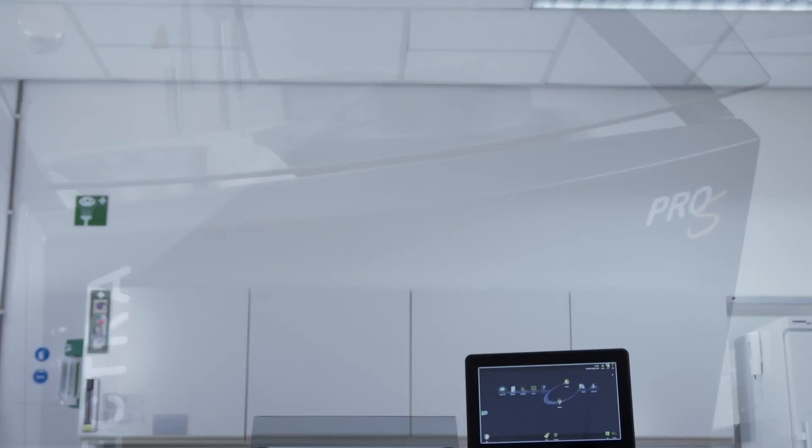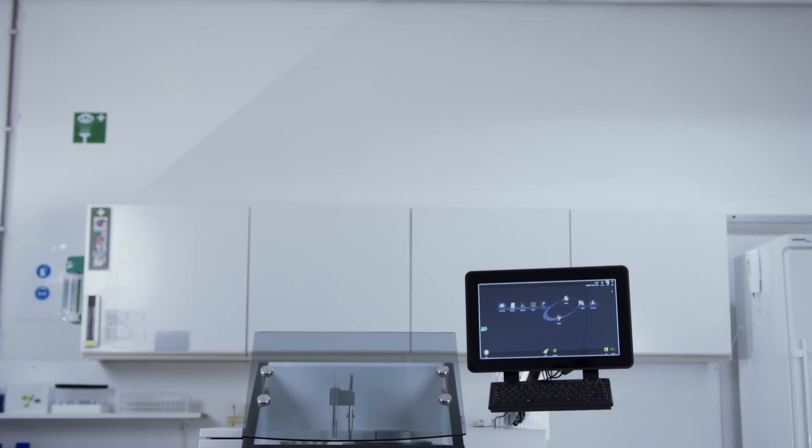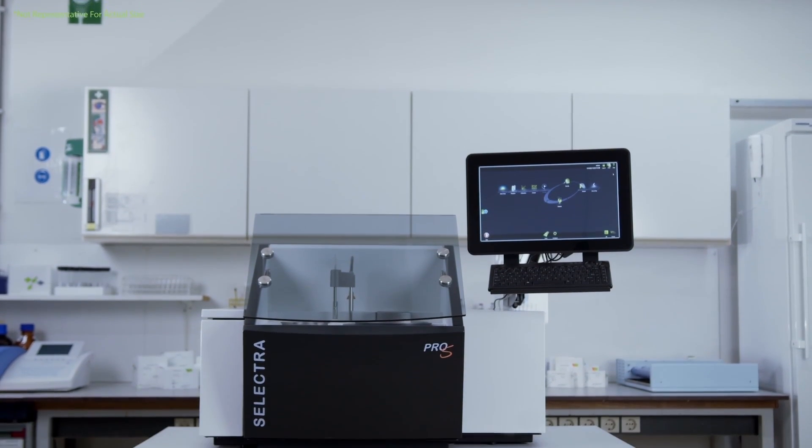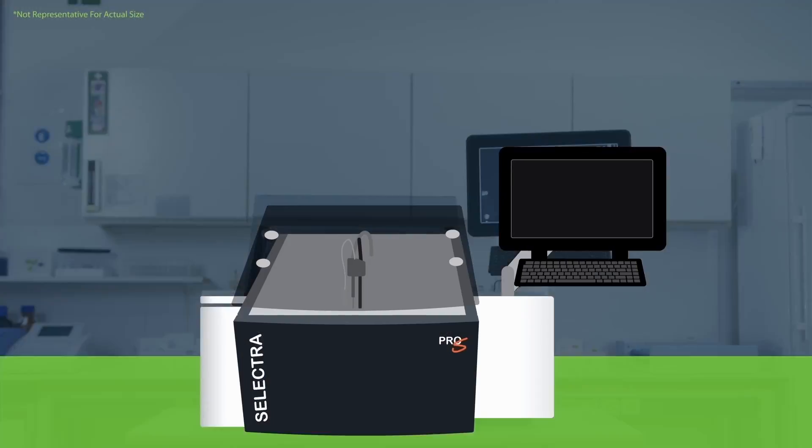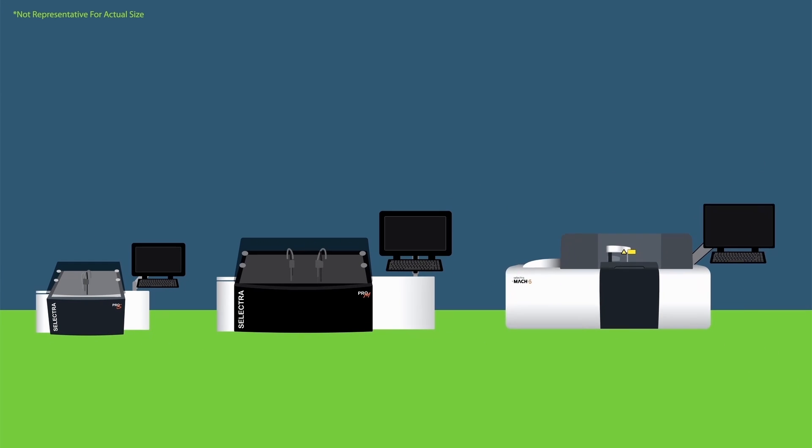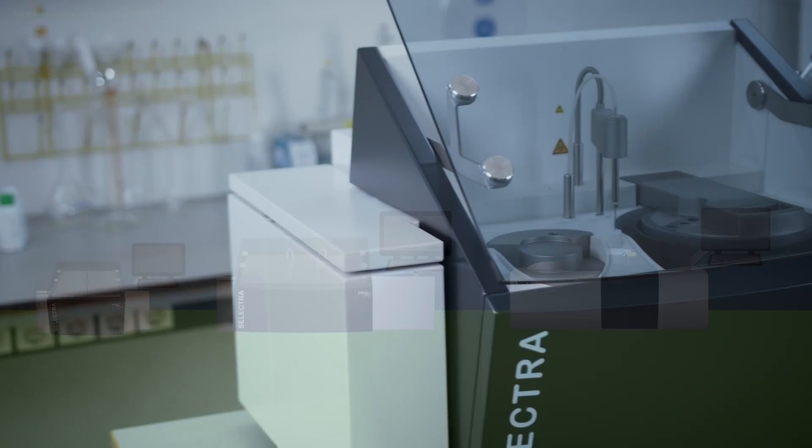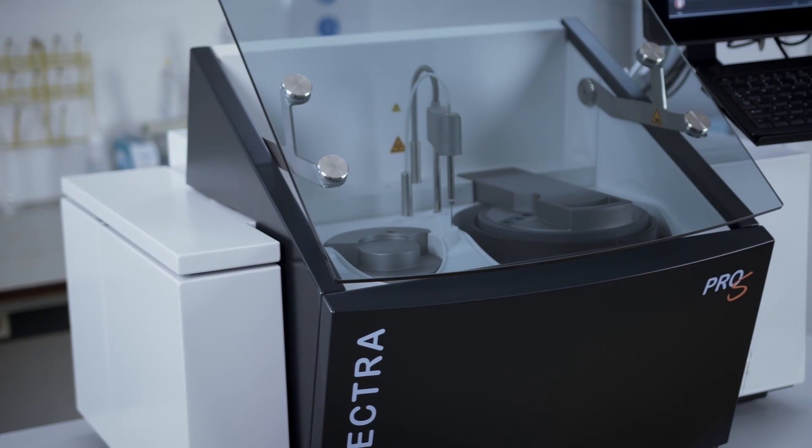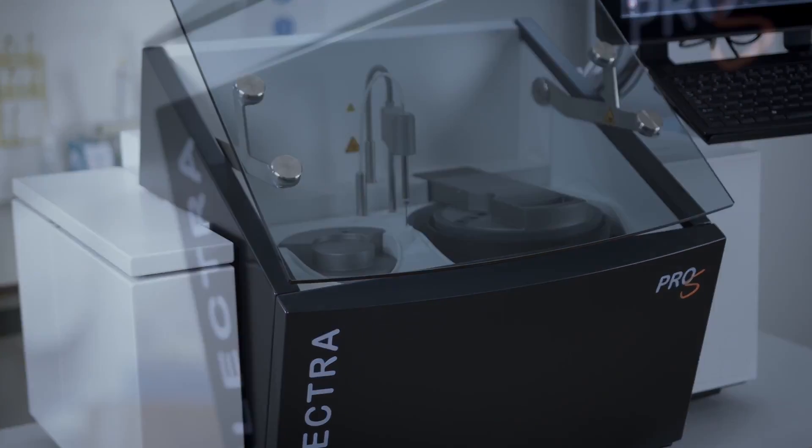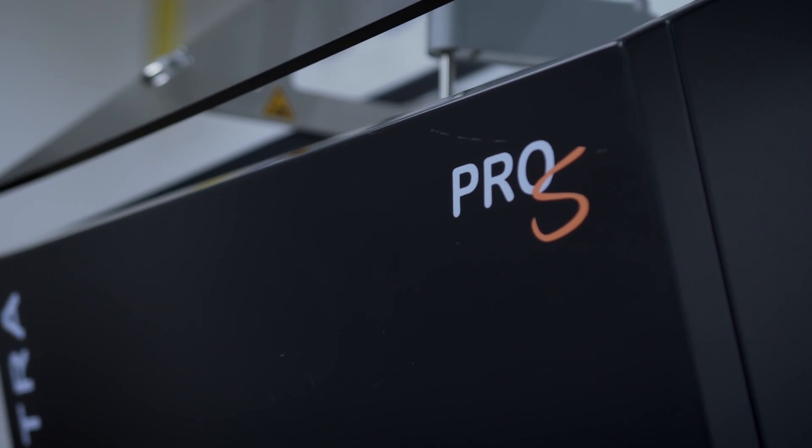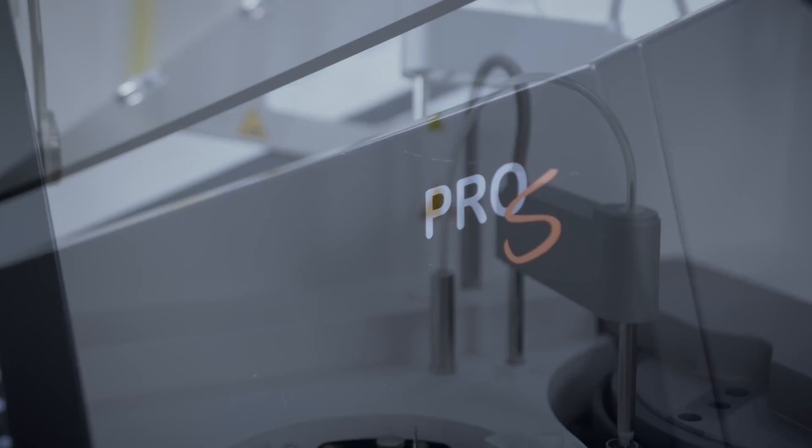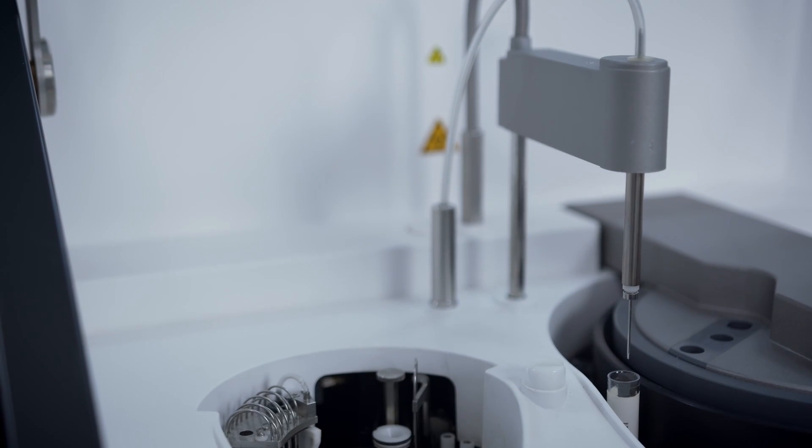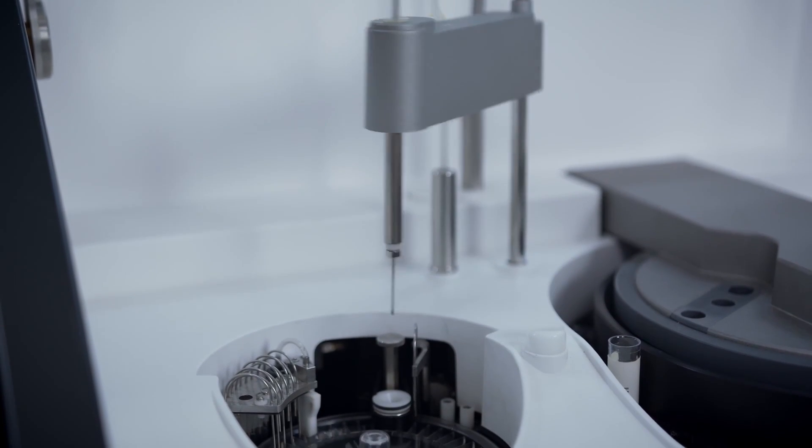Selectra Pro-S benchtop solution for clinical chemistry is the smallest fully automated member of the Selectra family. Selectra Pro-S offers a reliable automated choice for laboratories with lower throughput requirements, handling automated primary, STAT, and backup testing.